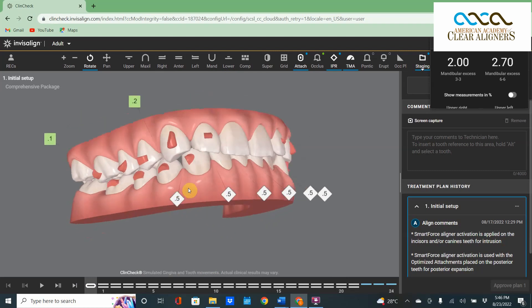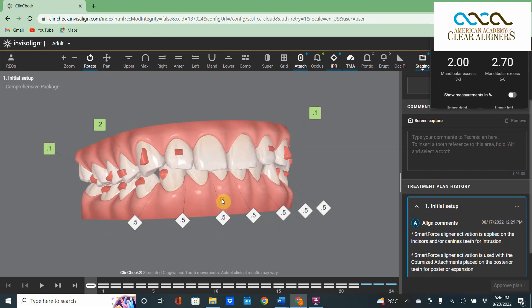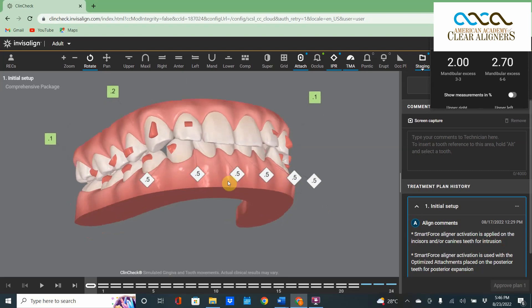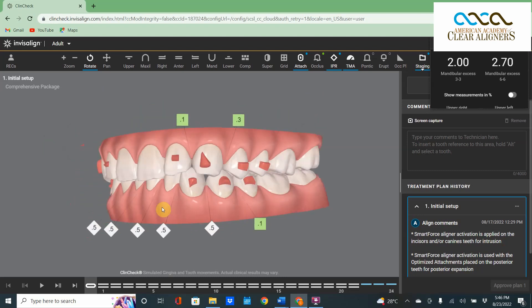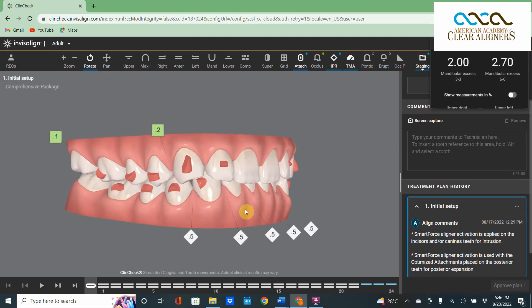This case needs lower anterior extraction or just referral to an orthodontist. Hear ye, hear ye.